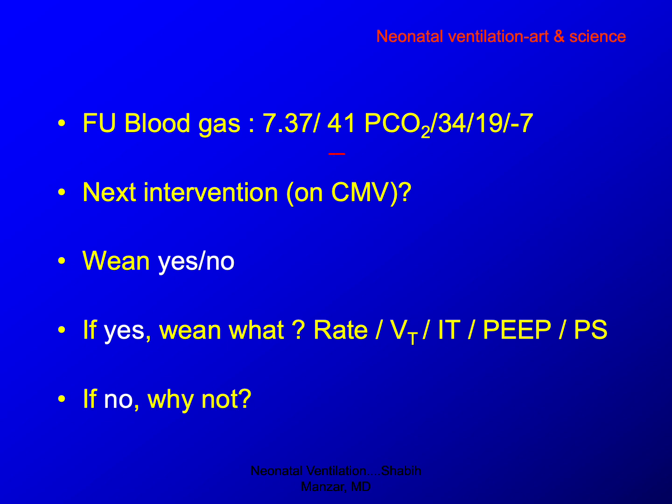So PCO2 has come down, the pH has improved. So what do you guys want to see? Wean something or leave everything the same? What do you guys want to do?